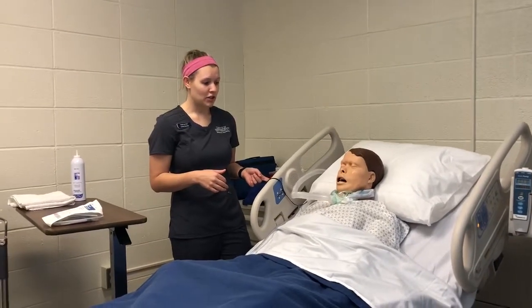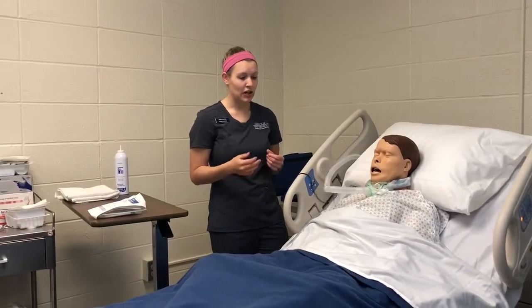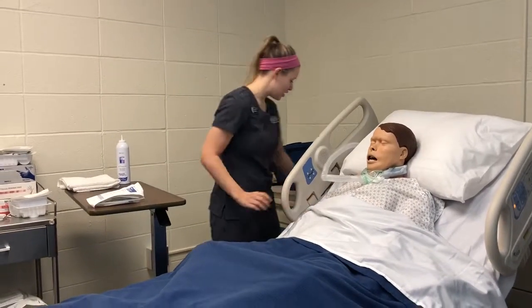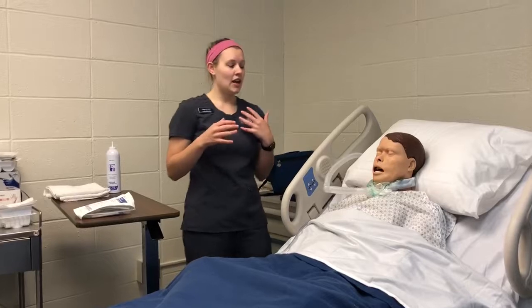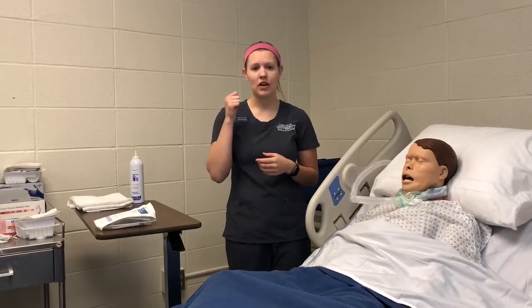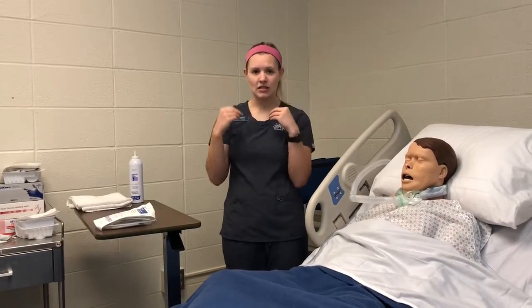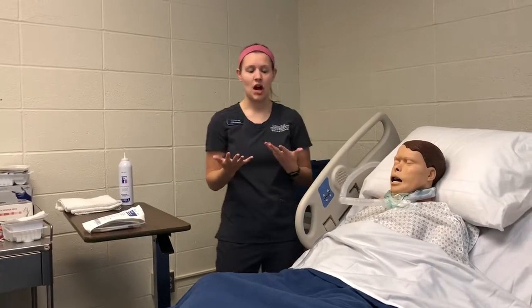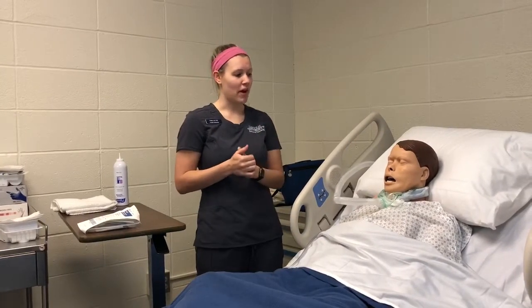And I also want to make sure that, since my patient can't communicate with me very well, sometimes when they have a trach, I establish some kind of sign with my patient to where if I need to stop because they're uncomfortable, they'll raise a thumb at me or blink their eyes. So in this case, we're just going to have my patient put a thumbs up if I need to stop or give them a break or anything like that.